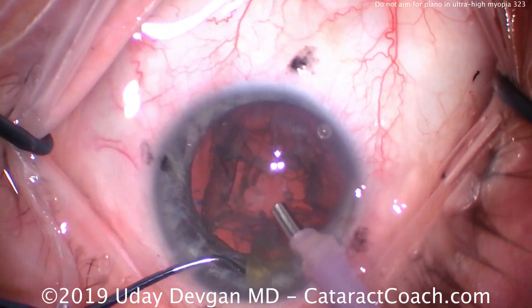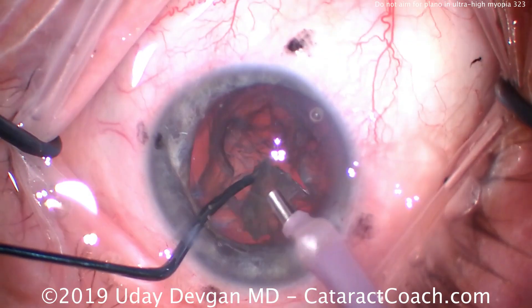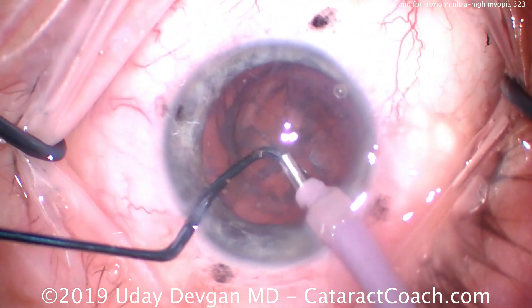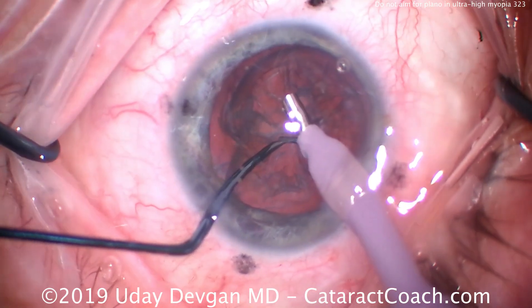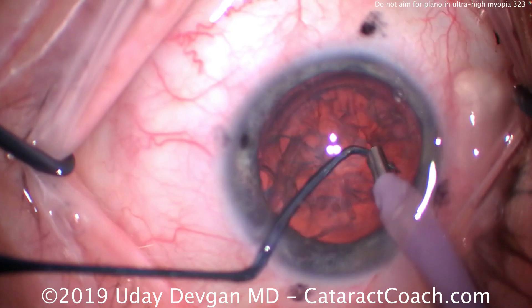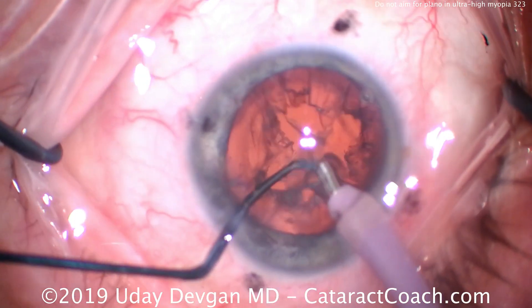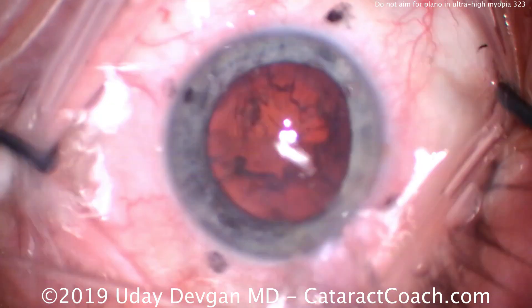That looks great. At the very end, there's one last piece of nucleus. Any remaining cortex or epinucleus, we'll get that out with the I/A probe. We can try a bit here to get out some of the epinuclear shell, but if there are any doubts, it's just easier to do it with the I/A probe — so let's switch over to that now.